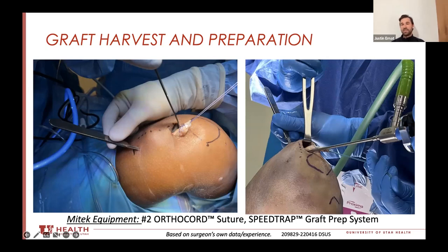As I go to tension, by having over-drilled the tibia, I'm not going to bottom out the bone — I'll be able to maximally tension the graft and not make my graft loose or redundant, allowing suspensory fixation on either side.